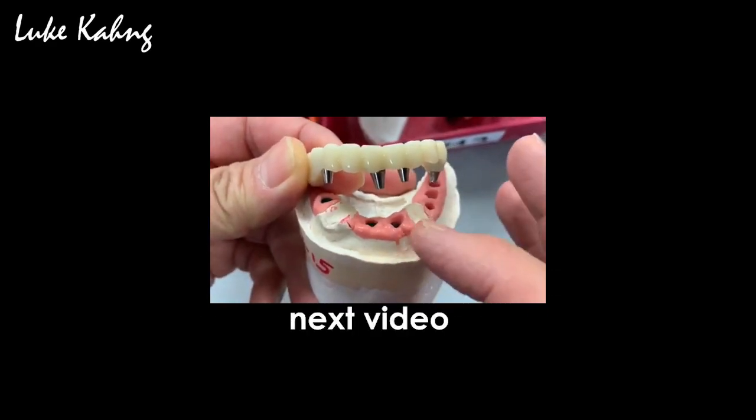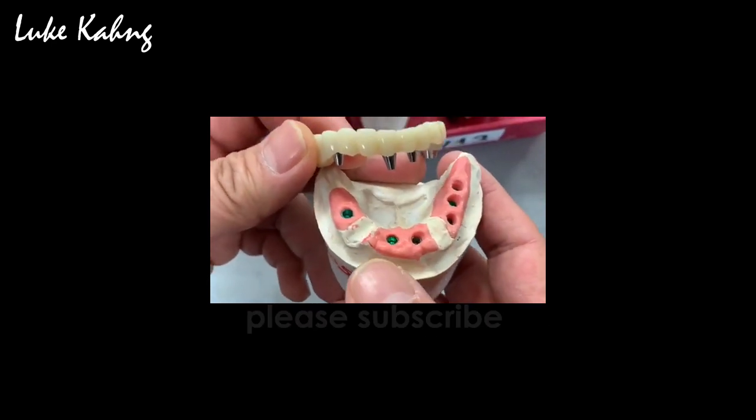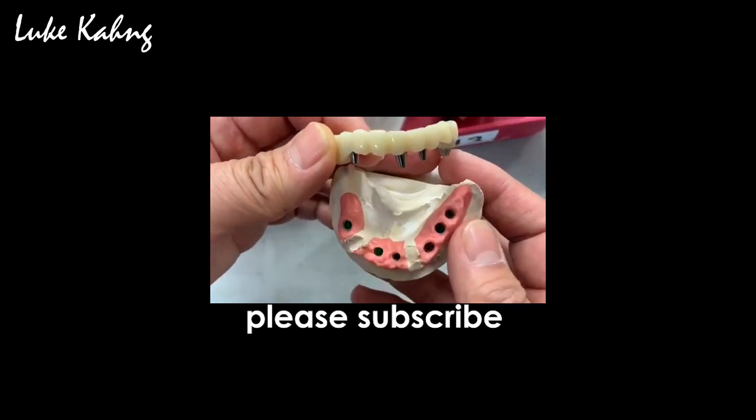This is a proper procedure, which is they extract the teeth, which we did, and then make the 6 implants.